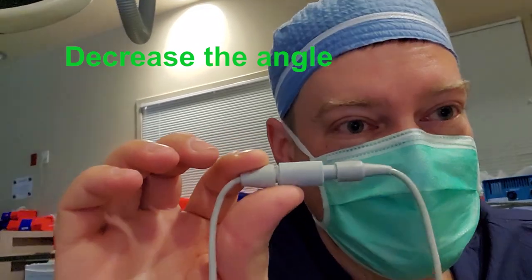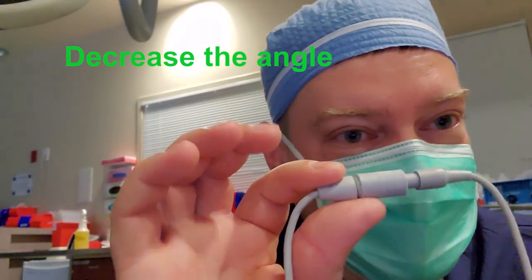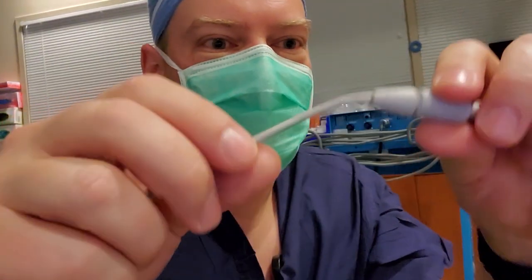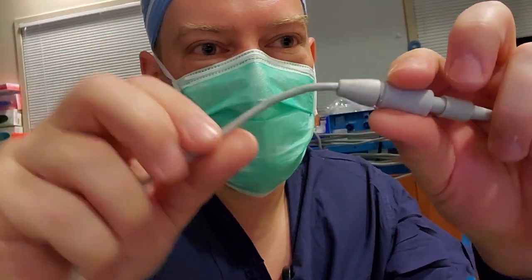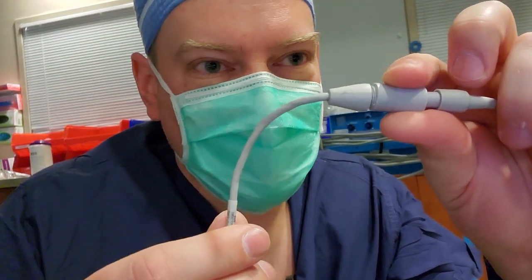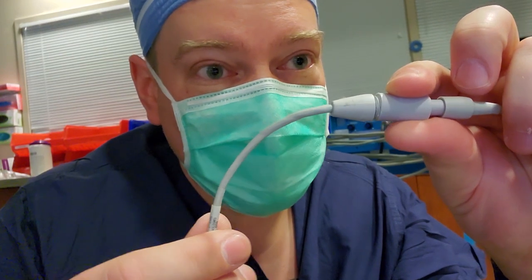Because the whole point to a strain relief is to decrease the angle of approach from the cable to the connector. Because like I said, the weak point of all cables is gonna be at the rigid structure, which is gonna be your connector. So what a strain relief is gonna do is it's going to decrease the angle of approach. So that might be your angle of approach with a shrink tube on it. But that is a normal angle of approach while they're using it. Because of the weight of the cable and whatever's attached downstream, that is the normal angle of approach.